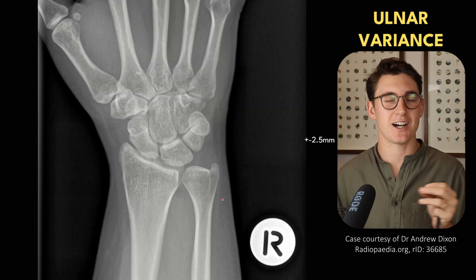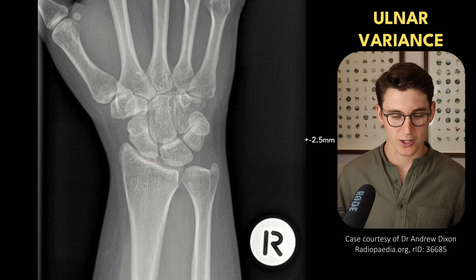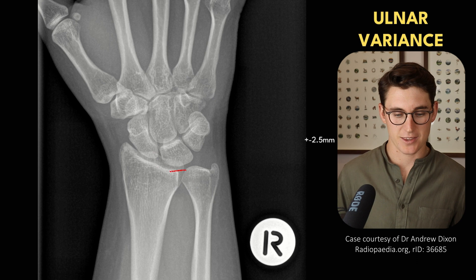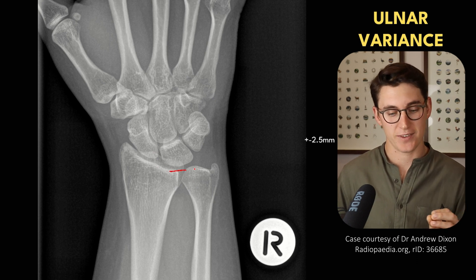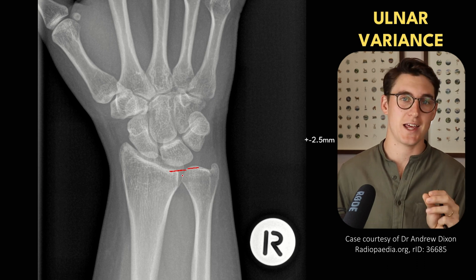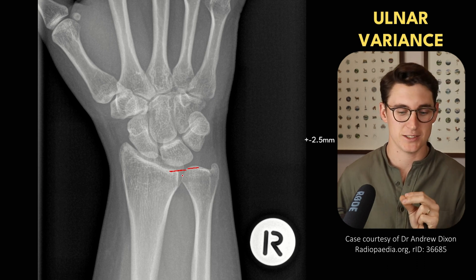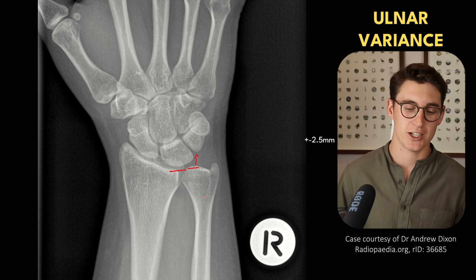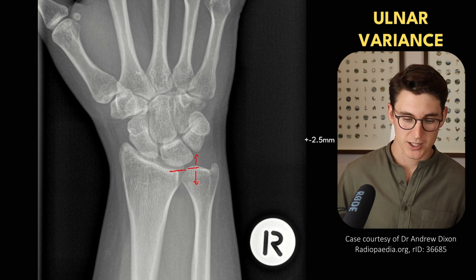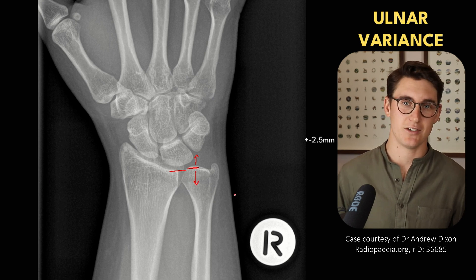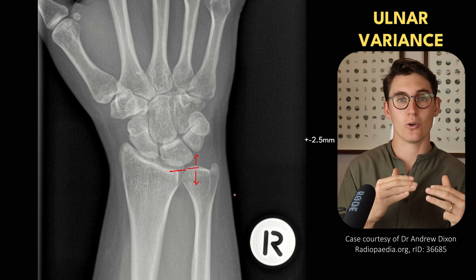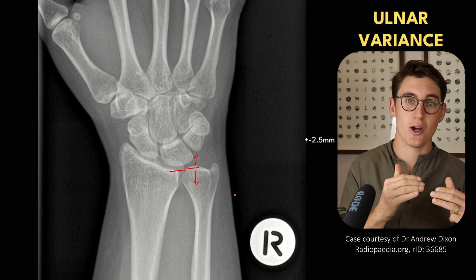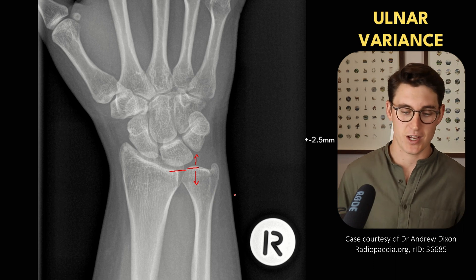The next thing we can look at is ulnar variance. We're looking at the radial articular surface and the variation between the radial surface and the ulnar articulating surface at the radio-ulnar joint. We want the difference between these two surfaces to be less than 2.5 millimeters. If the ulna is deviated distally it's known as positive ulnar variance; if deviated proximally it's called negative ulnar variance. Multiple things including fractures can cause ulnar variance to change.